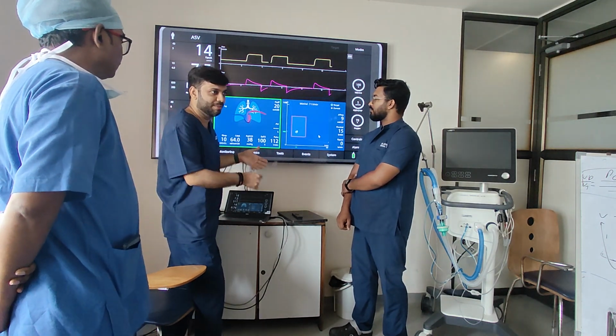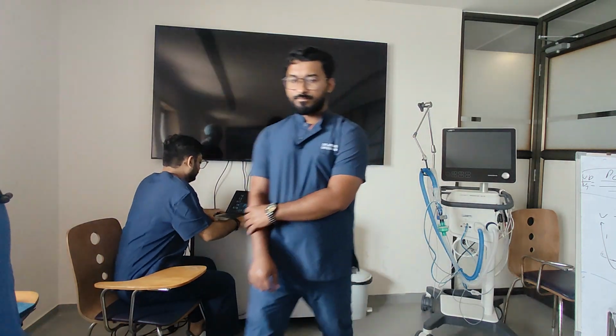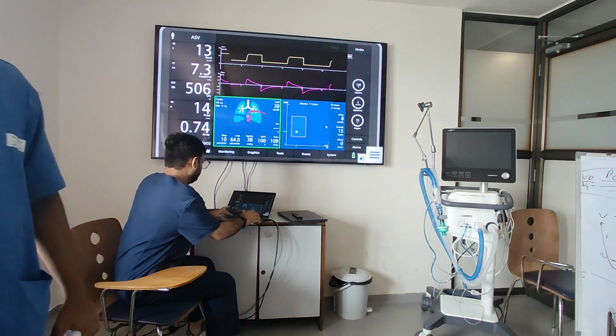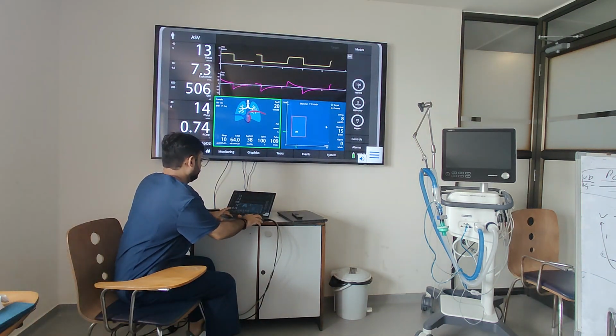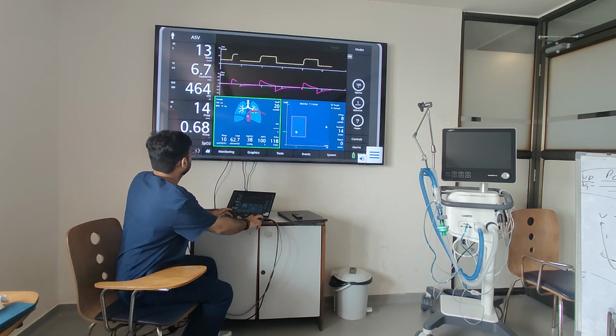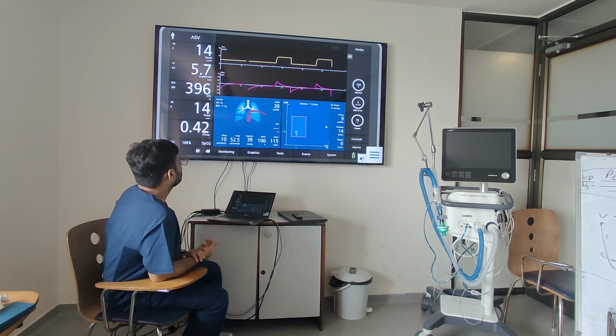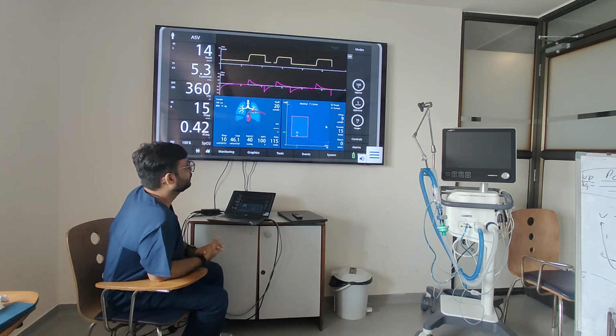Now I change some parameters, and I'll show you what exactly happens. Ashok, you must listen carefully, otherwise you will not pass the exam. These are simple things. She says you can adjust oxygen as you like, there is an option for that. That is purely what we want to do, like any other ventilator. So I'm trying to change something, and you will see what happens.